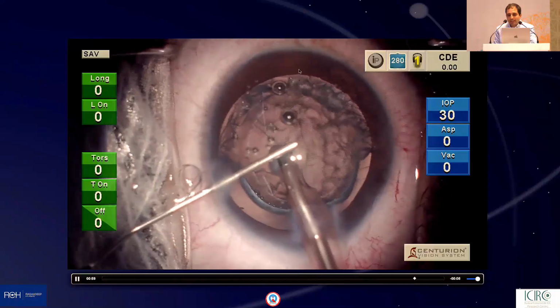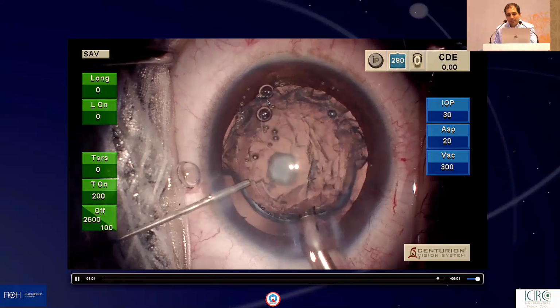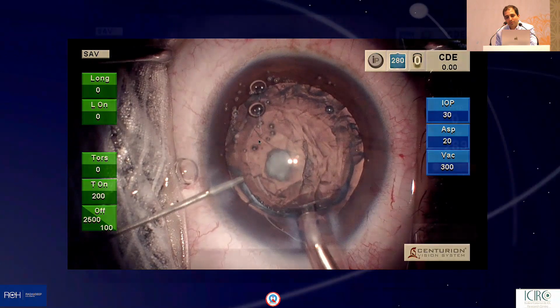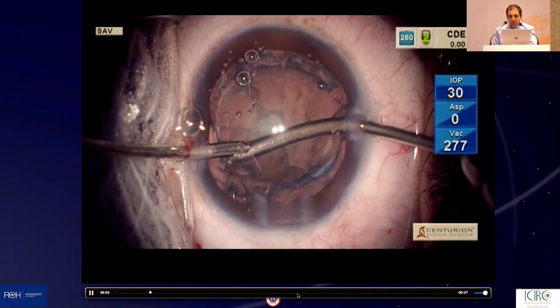So here, because there is a communication created, you can still go and hydro if it's a thick epinucleus plate. Make sure that you always inject dispersive viscoelastic before bringing out any probe. And fortunately, we followed all the principles.